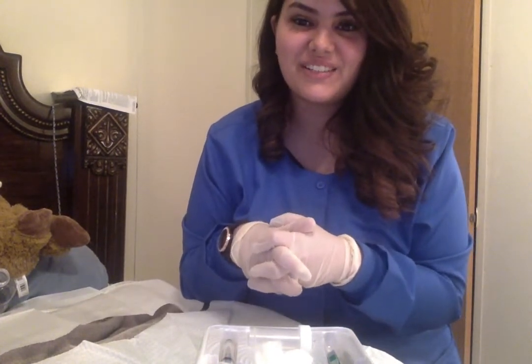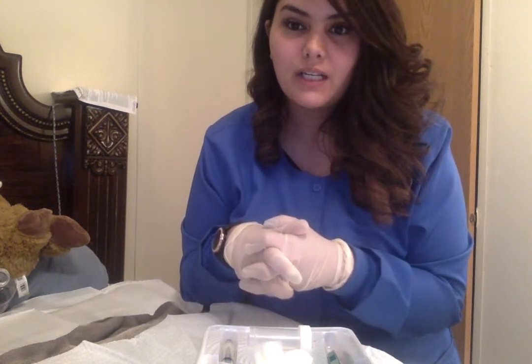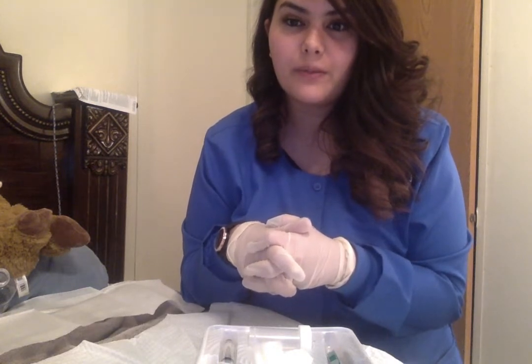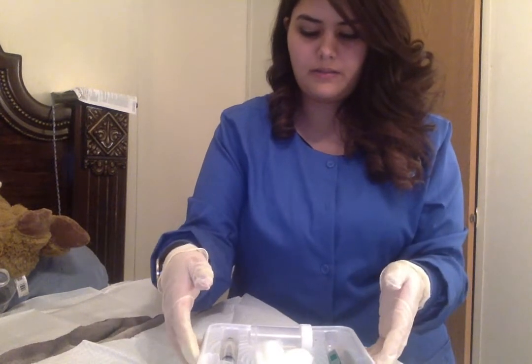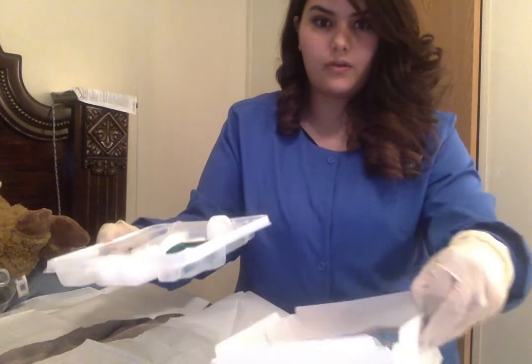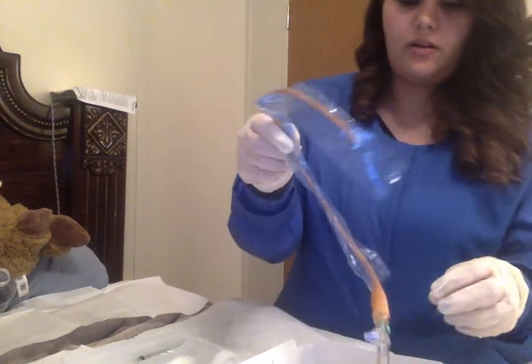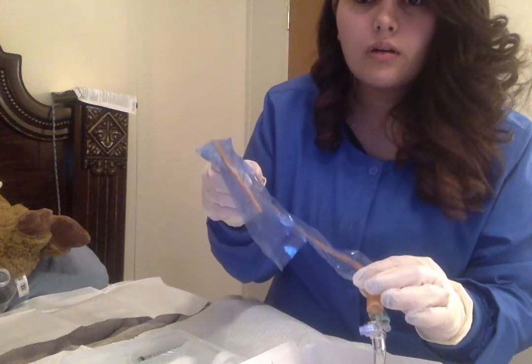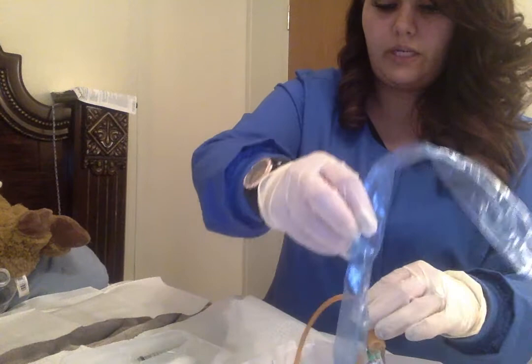Next we are going to remove the sterile wrapper of the container. So I guess that's this. Let's scoop this over. And we're going to take this off. Take this off and put it back in our thing.